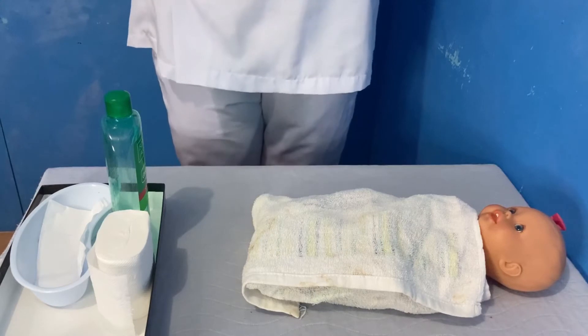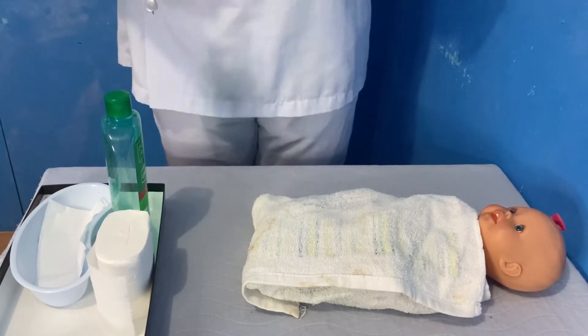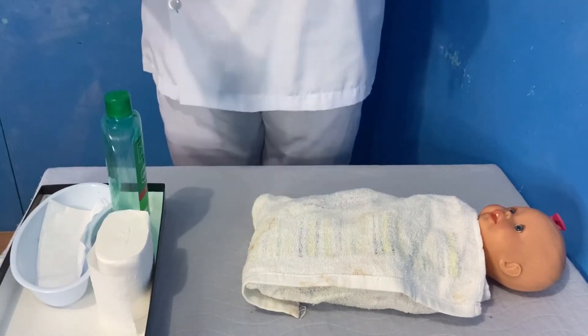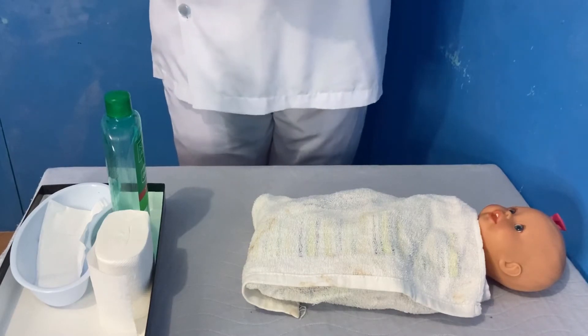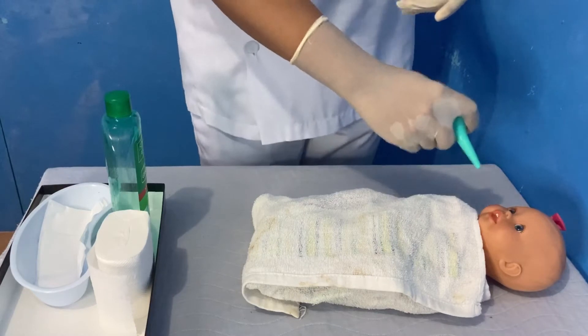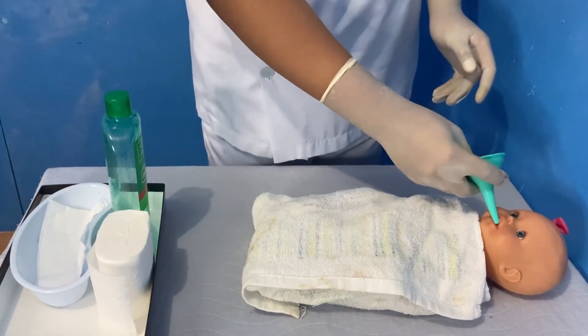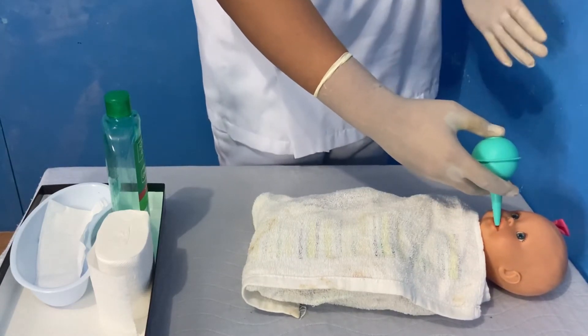For the procedure, as soon as the infant's head is born, suction the mucus from the mouth to prevent aspiration of secretion. Compress the bulb before insertion to prevent injury to the newborn's oral mucosa, and gently insert the tip of the bulb syringe into the dependent side of the newborn's mouth to collect drainage. Then release the compression on the bulb to allow re-expansion and collection of secretion.